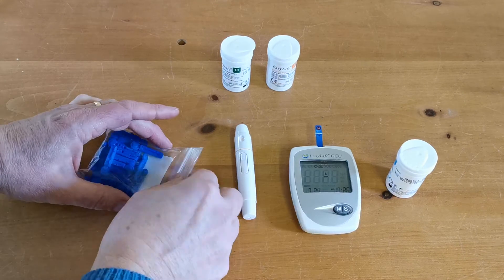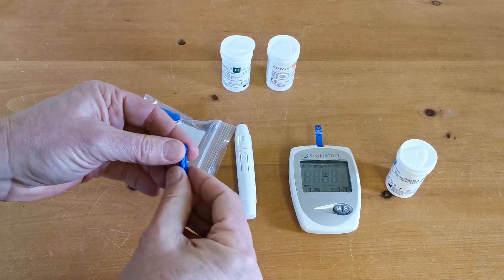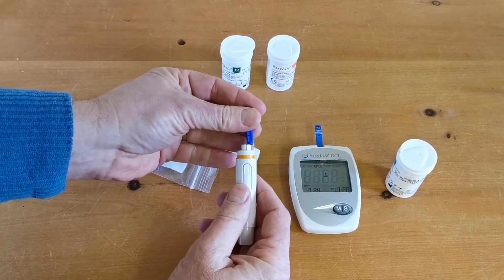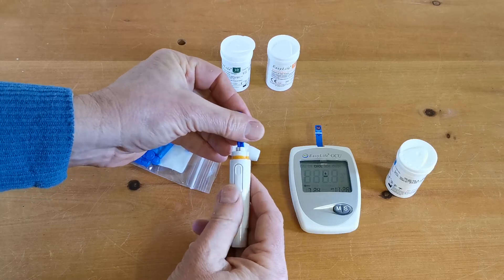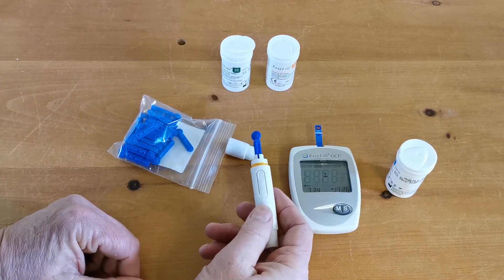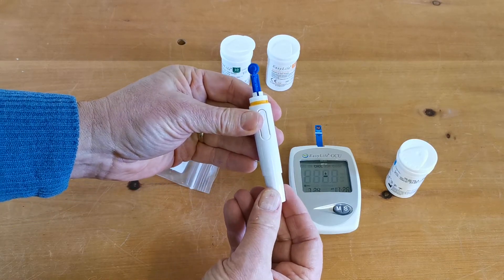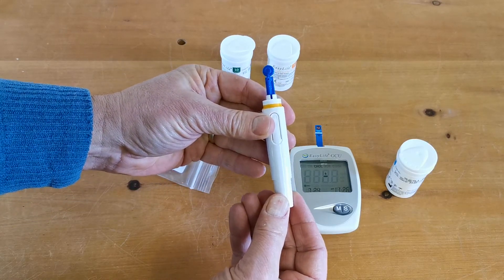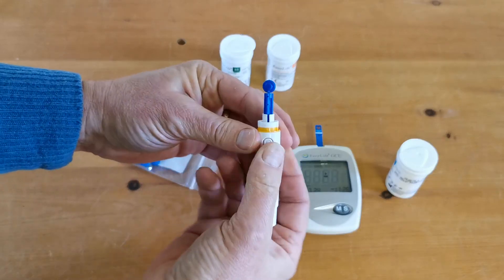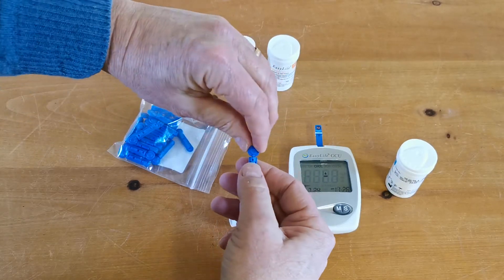To perform a test you need to take one of the lancets out of the packet and put it into the spring-loaded auto lancer. Push down firmly until it's into the base, and then to load the spring lancer just pull on this lever here — now that's ready to trigger.